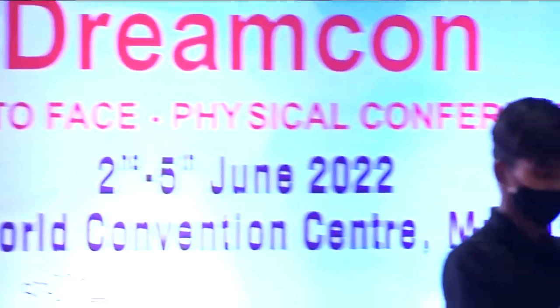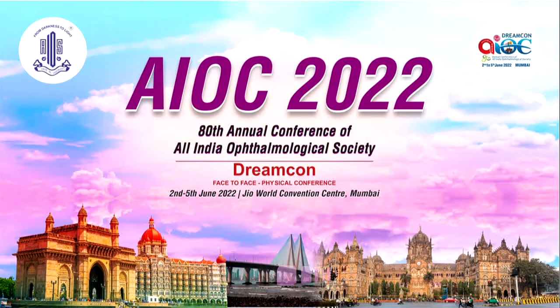Thank you, sir. I would be speaking to you about intraoperative OCT guided DMEK. Not that you need it. Only thing is your surgery becomes a little more refined, and it helps you understand the dynamics much better. There are no financial or proprietary interests.